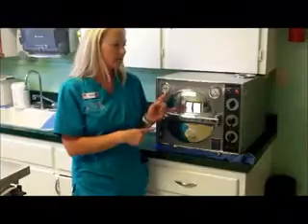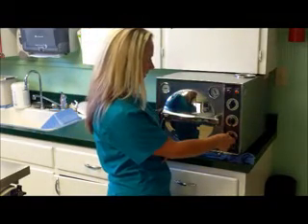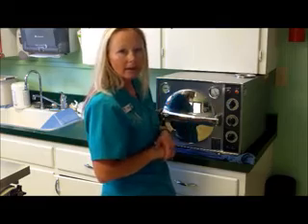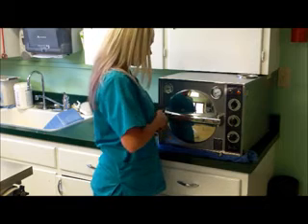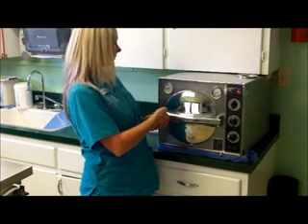The autoclave has stopped running, so we are going to switch this over to vent. Let the steam out for a few minutes before we open the door. So you don't have to sit here and watch this, I will turn the camera off for a minute. Okay, it's done venting, steam's all out, so we are going to open the door. Crack the door a little bit, and we'll finish letting the steam out for about 10 to 20 minutes, and then I will come back and pull the pack out.